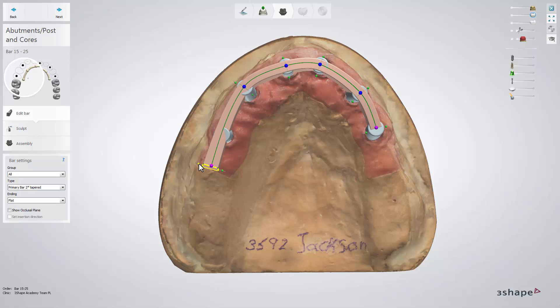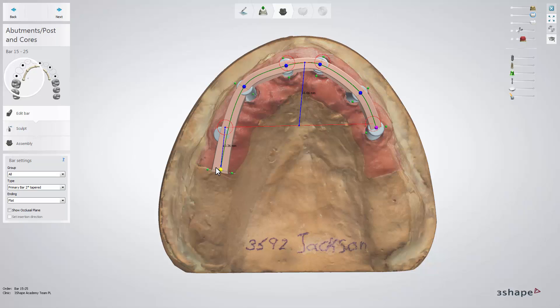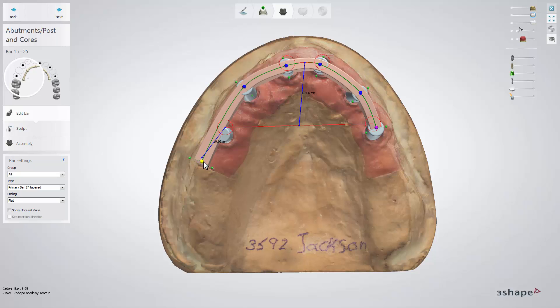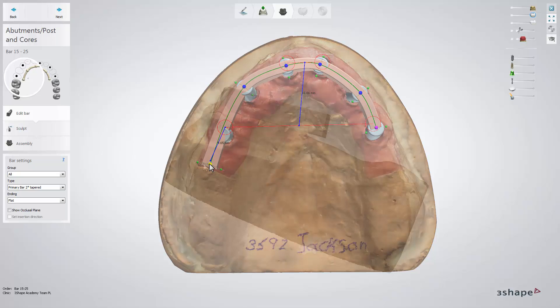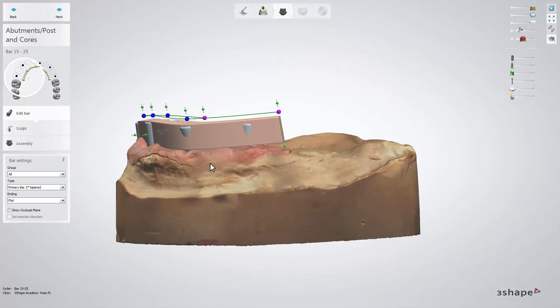You can adjust the bar length, and when the cantilever part of the bar exceeds the AP spread value of 1.5, it will be highlighted red. It is essential to observe this limitation to ensure the reliability of the design.